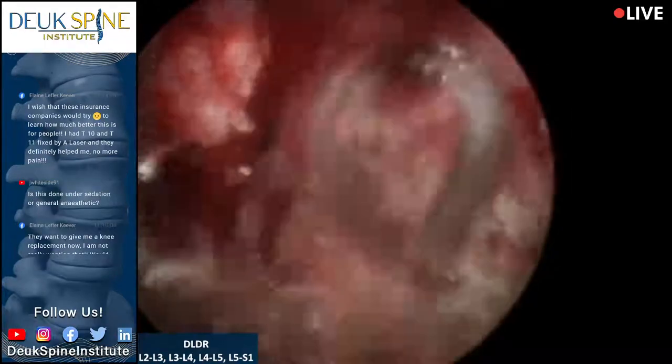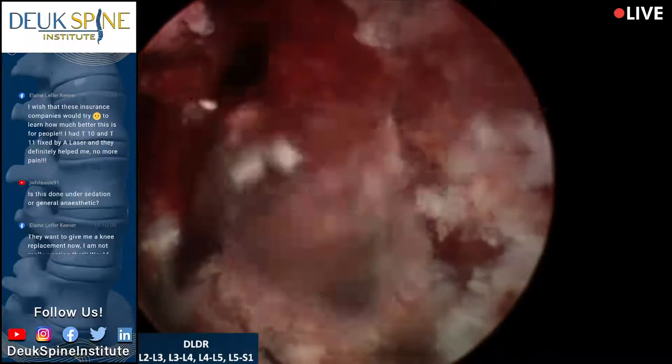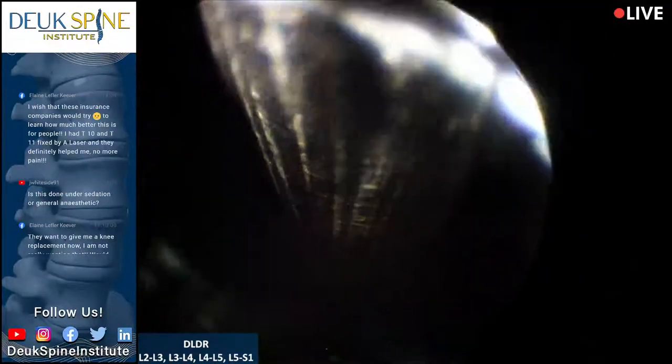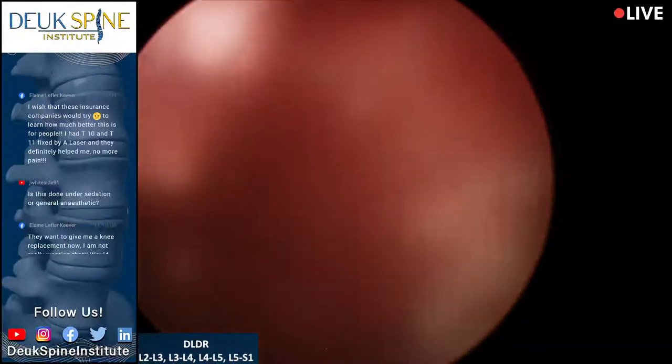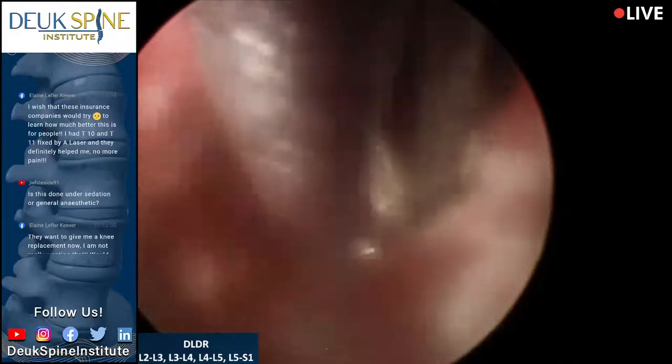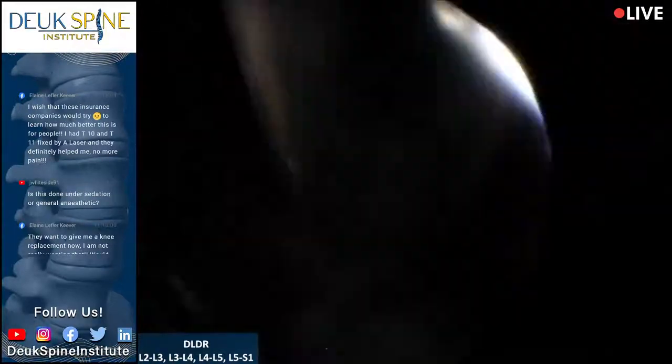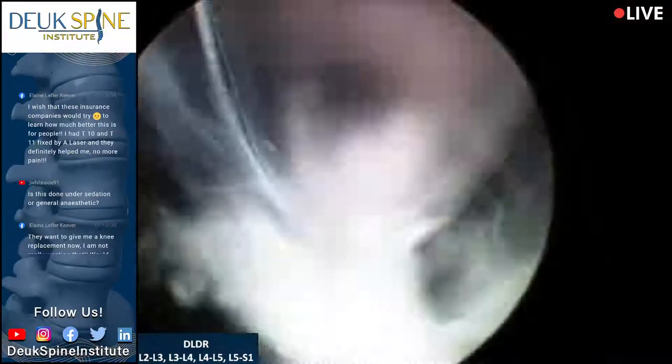We did a discogram here, right? We did it, yes. All right. There's not going to be much to do here. I can already tell you that. I need 5 minutes. This is the most collapsed of all. There's a piece of herniation right there.